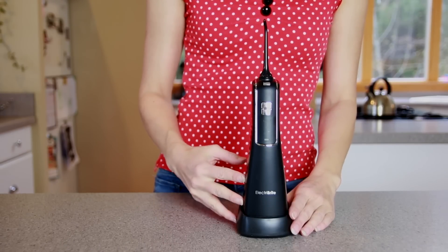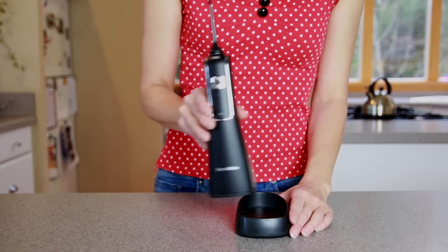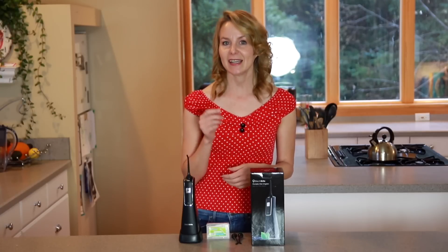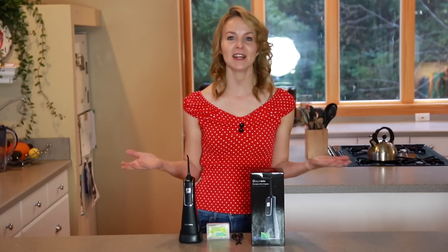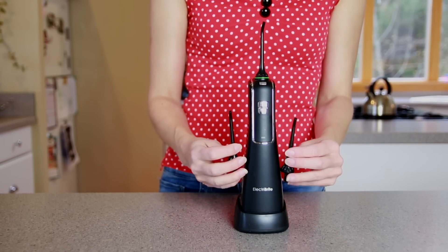It is wirelessly charged on the base, which is very convenient, and can be used normally about 20 times when fully charged. The body is IPX7 waterproof and leak proof, and designed to be used safely even in the shower. It also has three jet tips which can be used for a family.